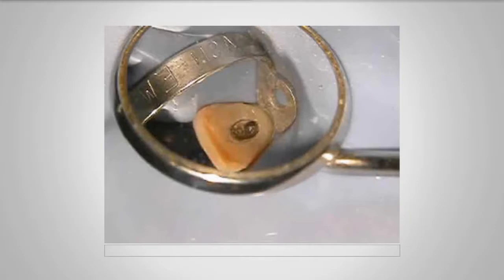And now what I'm going to do is use a small ultrasonic tip to vibrate the file. When you're removing broken instruments, it's essential that the force is applied to the lateral aspect of the broken instrument. If you touch the tip of it or the head of it, then it tends to disappear further into the root canal. And certainly when you're working deep in the root canals, this is very important, because otherwise you're going to make your job harder. So you use an ultrasonic tip. You could, in this case, probably even use a scaler tip, but it needs to touch the side of the broken instrument. Let's have a little look at this.